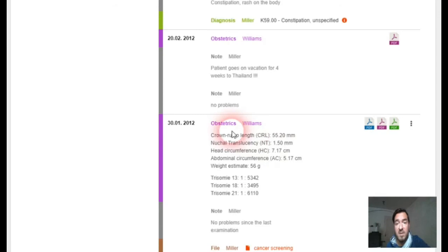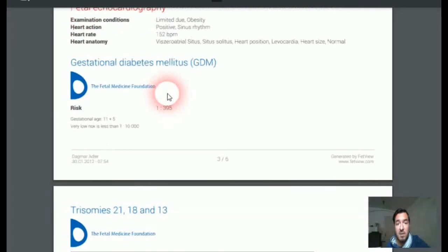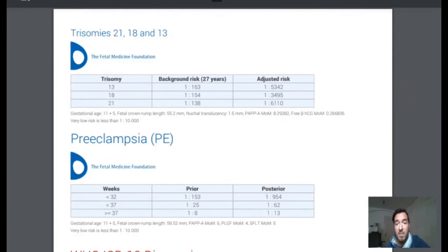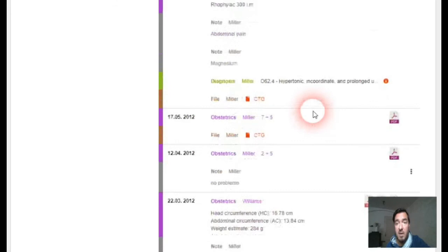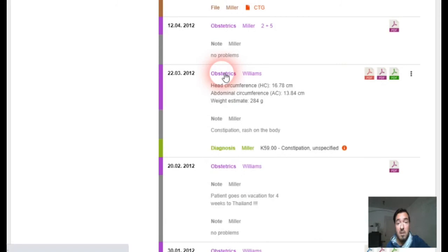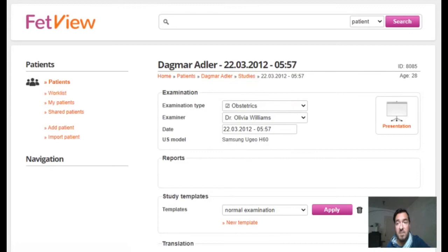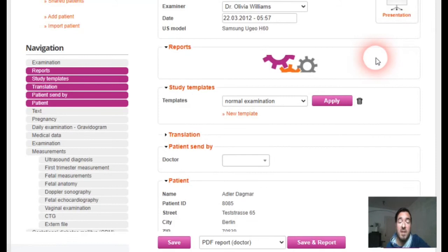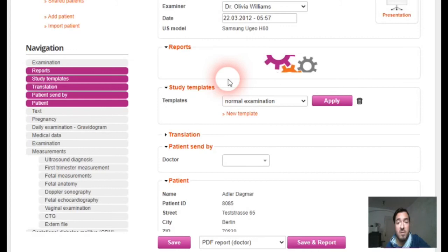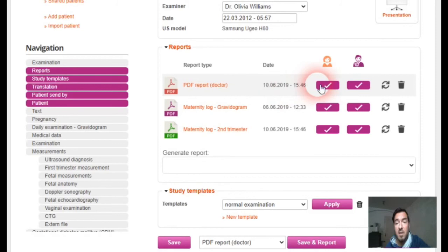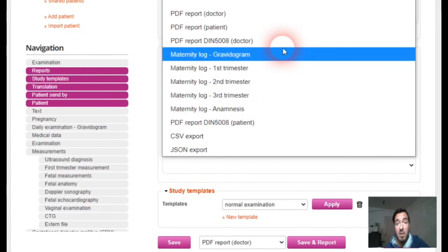Over time you will know which report has which color. For example, if a report includes the first trimester screening, it is blue because it includes the FMF first trimester screening calculations. You can access it here, and of course if you go to an examination on a certain date, all generated reports are displayed just in the upper part of the examination. You can also regenerate the report if you change something, share it with the doctor and the patient, or generate a new one.